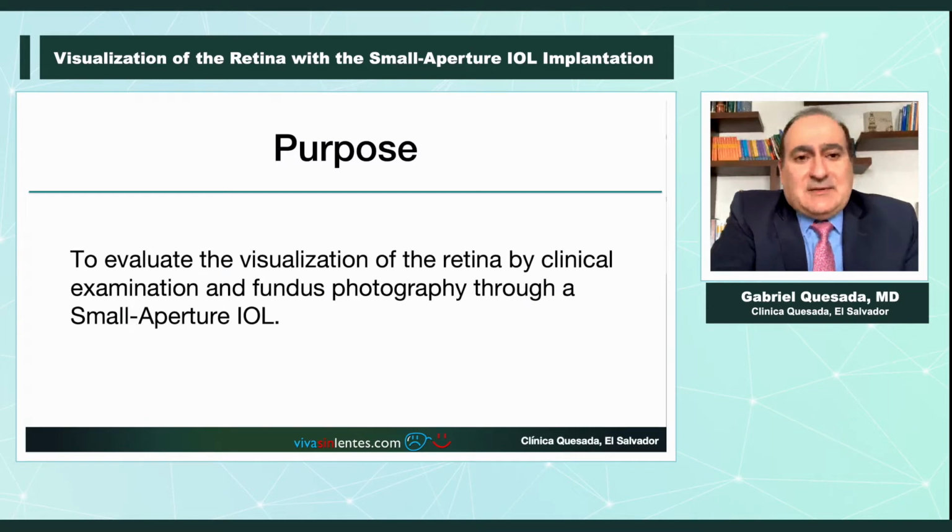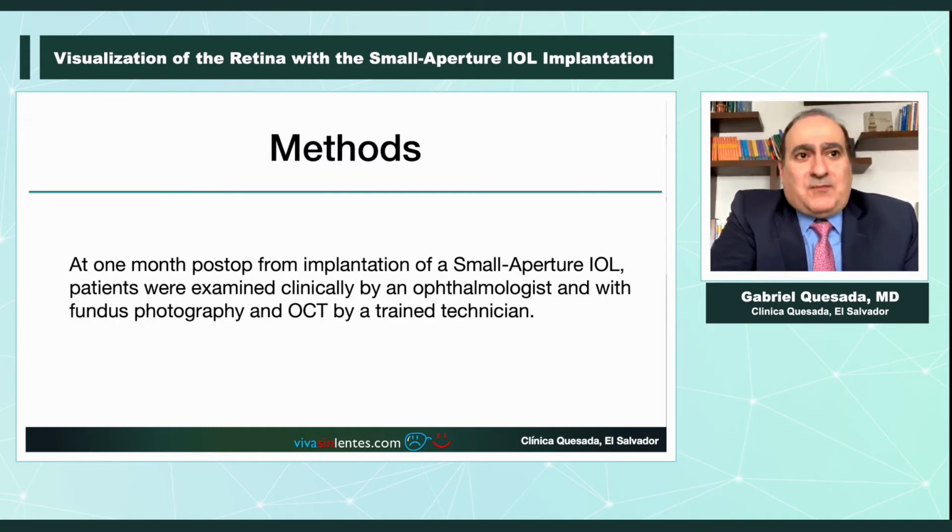So again, the purpose of this study was to evaluate the visualization of the retina by clinical examination and fundus photography through a small aperture IOL. At 1 month post-op from implantation of the AcuFocus IOL, patients were examined clinically by an ophthalmologist and with fundus photography and OCT by a trained technician.